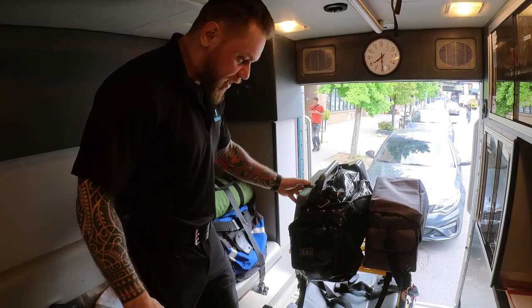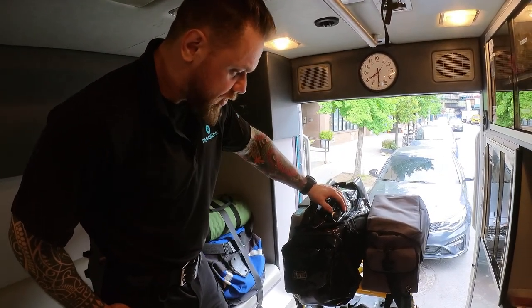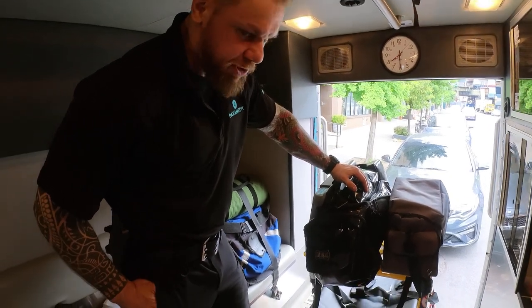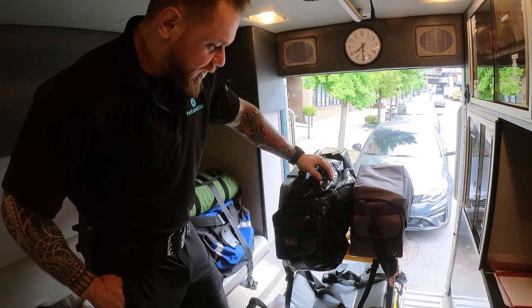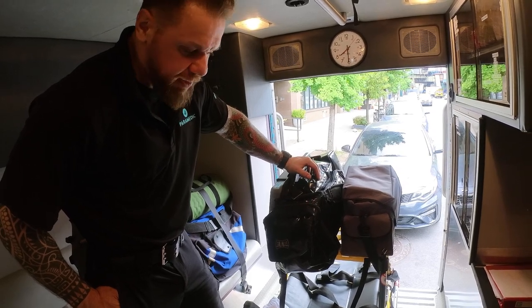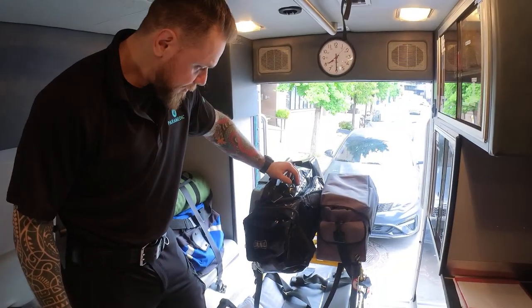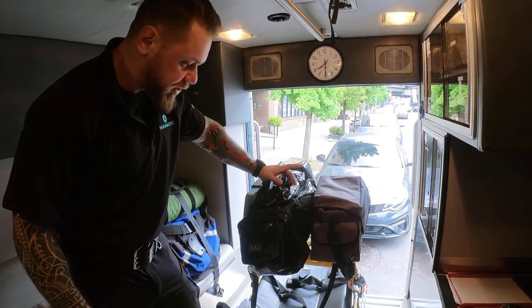I would not exceed 30 pounds, which is the max weight. I've seen people mounting a ventilator and O2 here — that's not the best spot. I usually prefer my O2 and ventilator in the back of the stretcher and I'll do another video showing how I like to do that. Now I'm going to re-secure the monitor in the standard configuration.